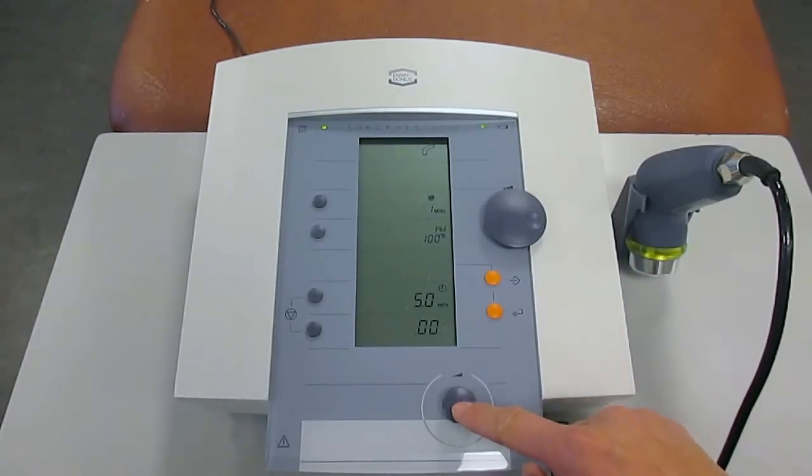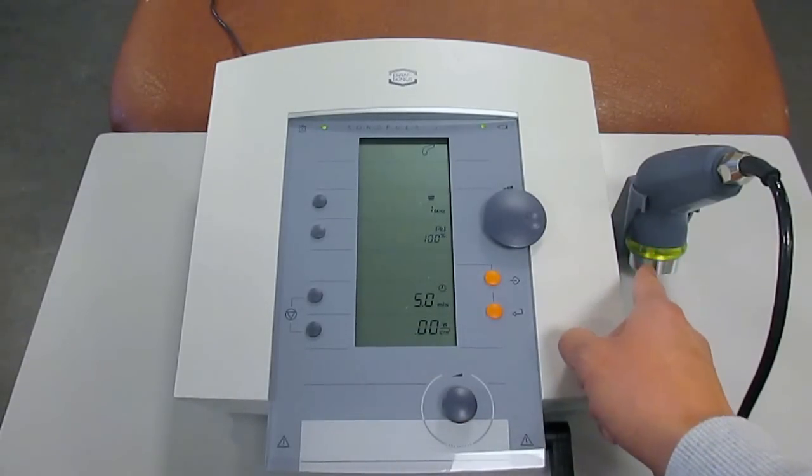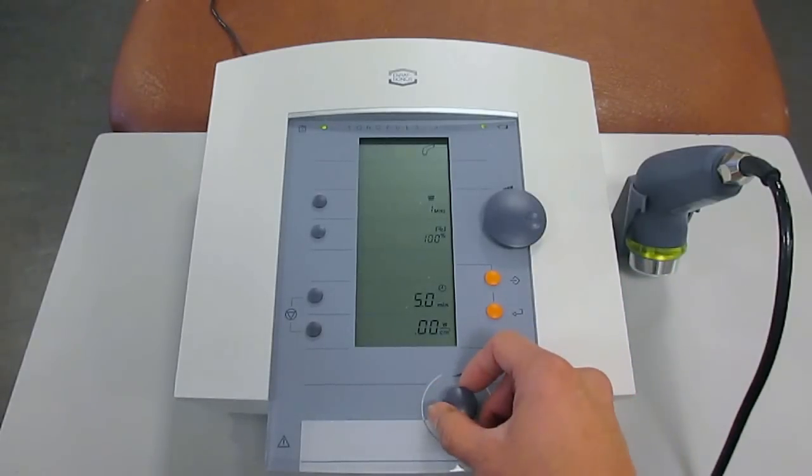This dial located right here increases the ultrasound dosage or the ultrasound intensity. You turn it clockwise to increase and you turn it anti-clockwise to decrease the intensity. Usually what you would do is put the ultrasound head with the ultrasound gel on the soft tissues before you turn on the ultrasound intensity. But for the purposes of demonstration, I can simply just turn it on just for you to see.